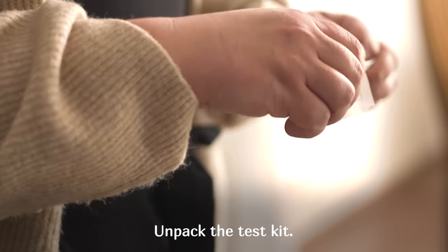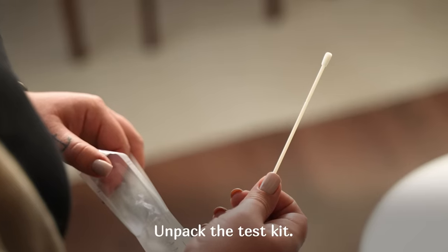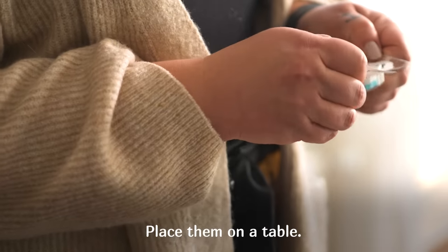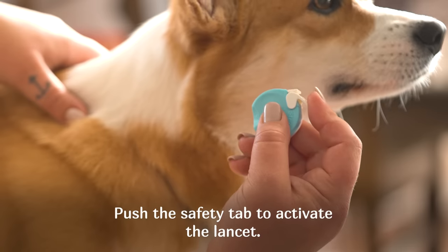Unpack the test kit and place the items on a table. Push the safety tab to activate the lancet.